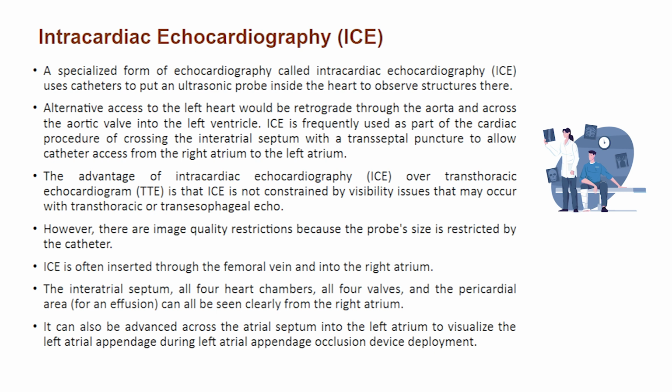The advantage of intracardiac echocardiography over transthoracic echocardiogram is that ICE is not constrained by visibility issues that may occur with transthoracic or transesophageal echo. However, there are image quality restrictions because the probe's size is restricted by the catheter.